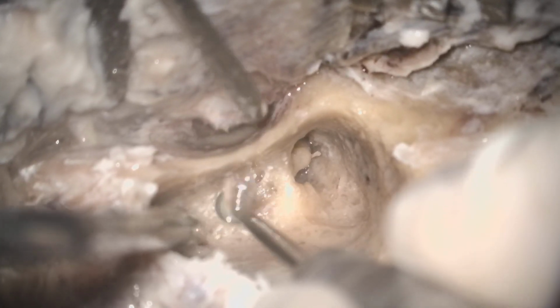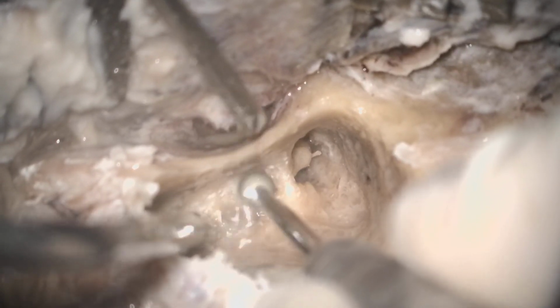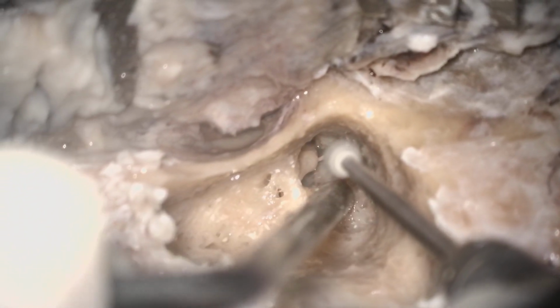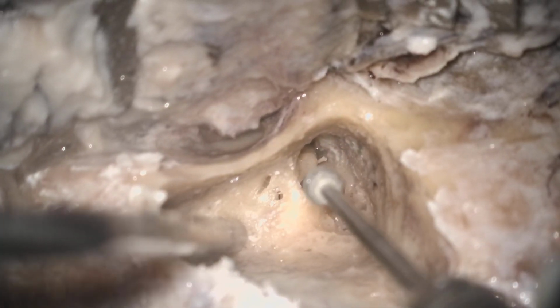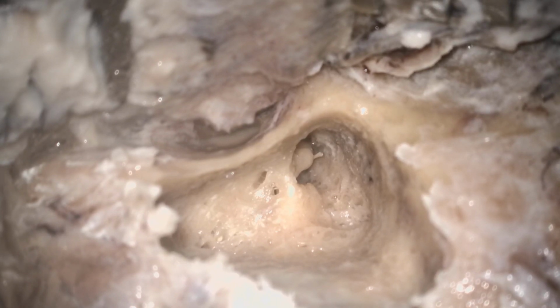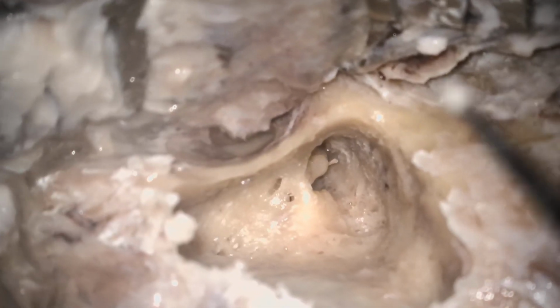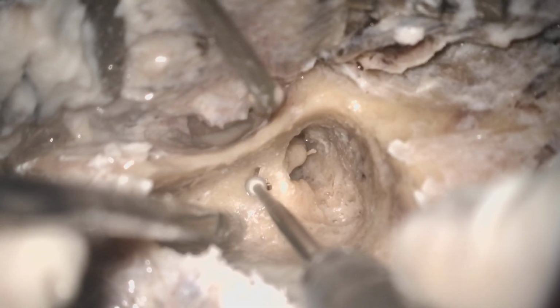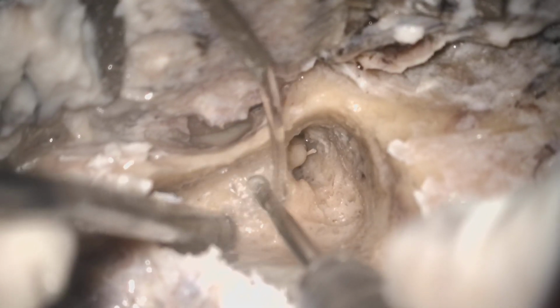So when you are doing a transmastoid facial nerve decompression, you have to do a proper posterior tympanotomy to reach the tympanic segment. And in that part, we have to sacrifice the incus buttress. We have to remove the incus so that we can visualize the tympanic part of the facial nerve. So for transmastoid facial nerve decompression, we have to remove the incus buttress. But before removing the incus buttress, first you have to open the facial recess area.